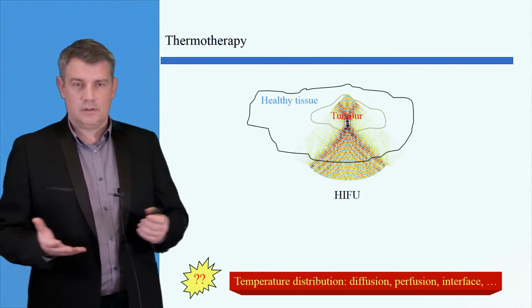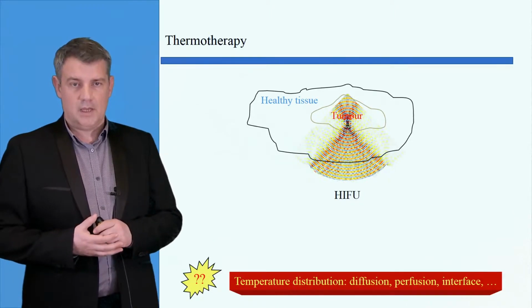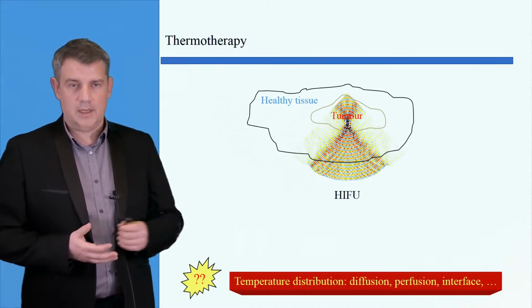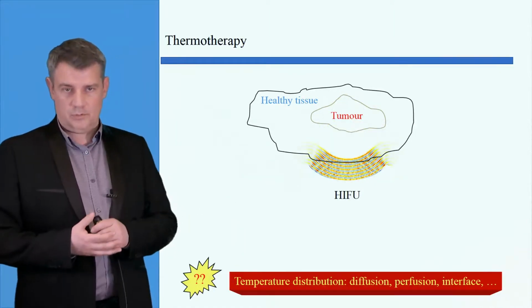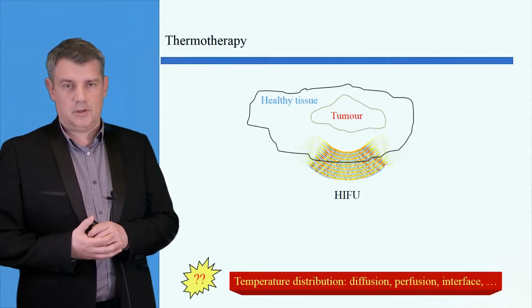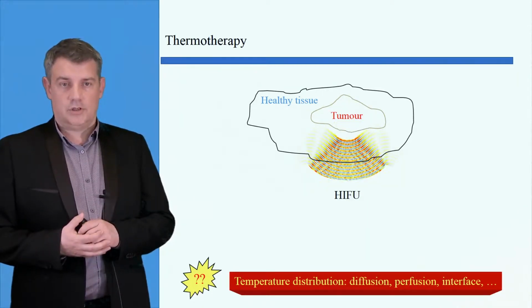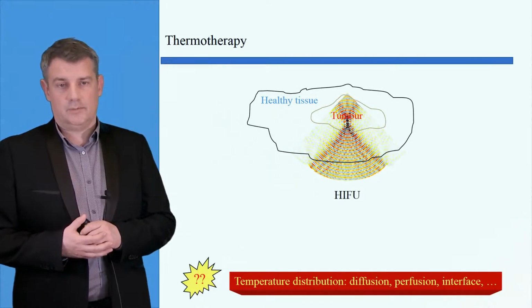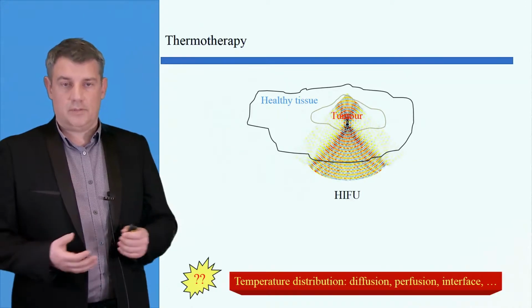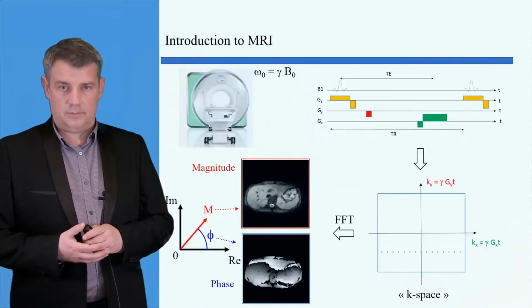If we consider the general objectives of the HIFU treatment, it is, for example, to treat a tumor non-invasively. For this, we want to sonicate and send energy from outside the body to the targeted tumor while trying to avoid producing damage on the surrounding healthy tissues. Since we want to induce temperature change, it's obvious that we would like to have a monitoring technique, an imaging technique that would allow us to map, ideally in real time and in 3D, the temperature distribution in the tumor and in the surrounding healthy tissue.